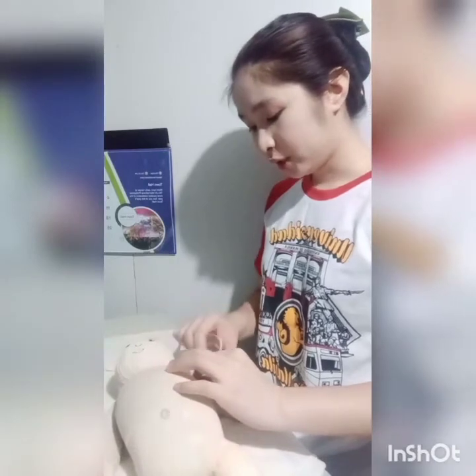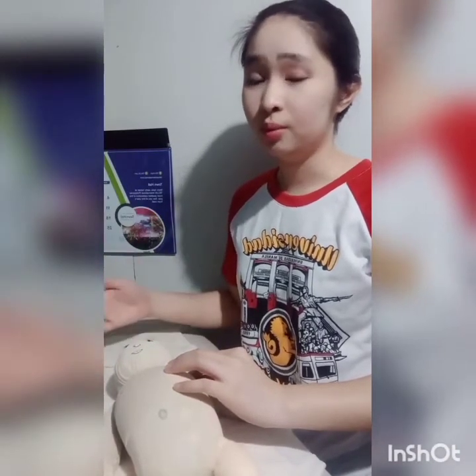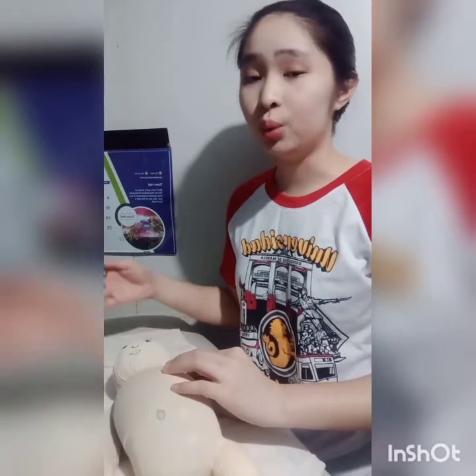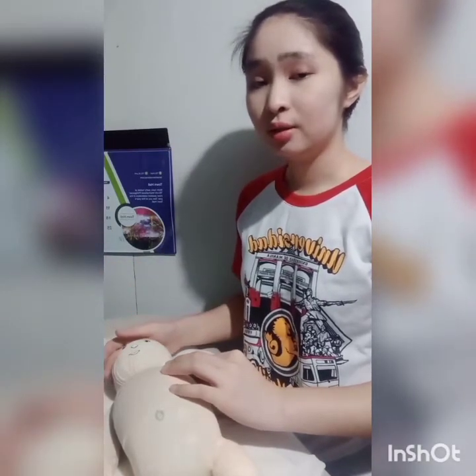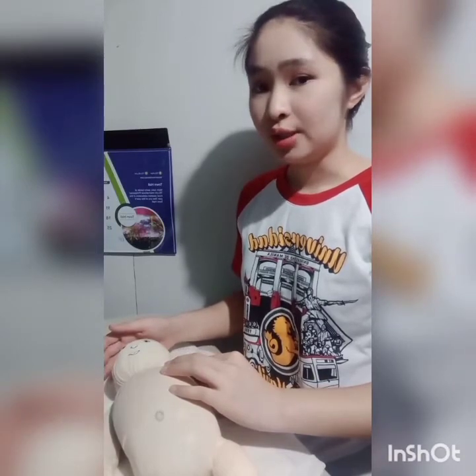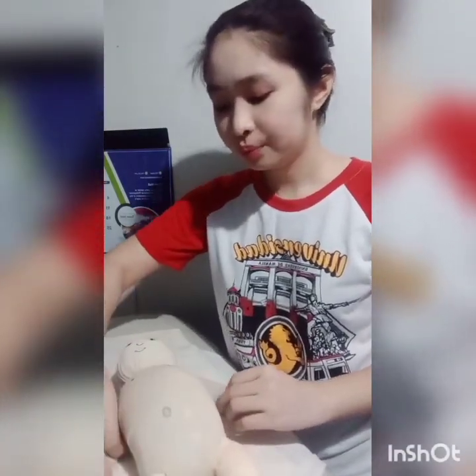Baby's chest, for a baby girl and also a baby boy with 42 weeks gestation, varies from 30 to 33 centimeters. So baby Emmy measures 30 centimeters chest circumference.